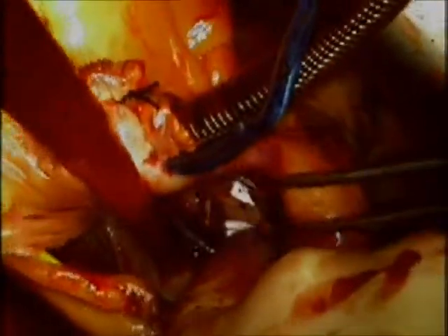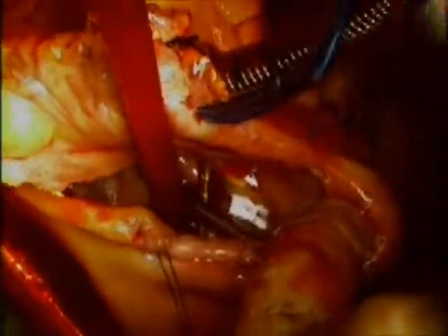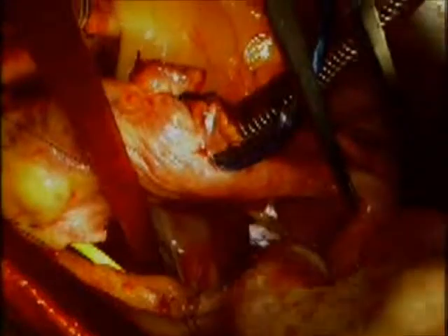It is extremely important to make sure that the right amount of commissure is pinched off. In a very large tricuspid annulus, sometimes I pinch off the commissure between the septal leaflet and the anterior leaflet. Most of the time you can have a good visual appreciation of how the tricuspid valve leaflets come together after this repair is carried out.